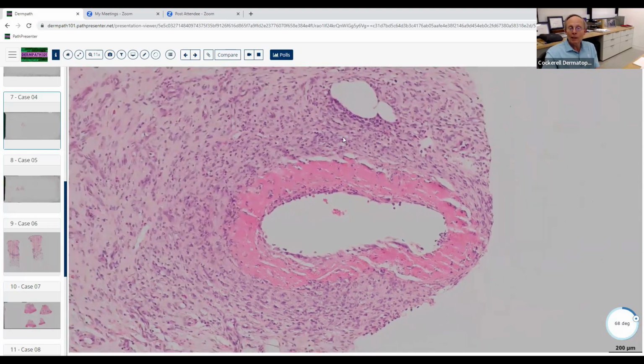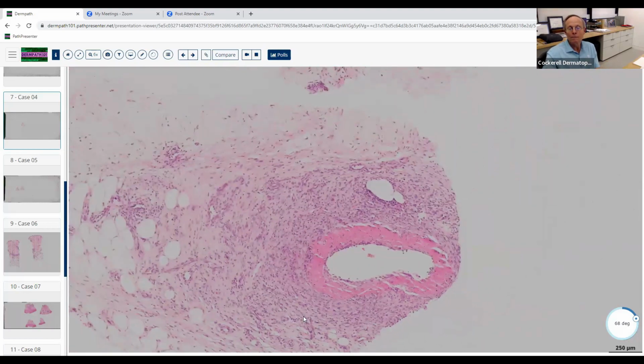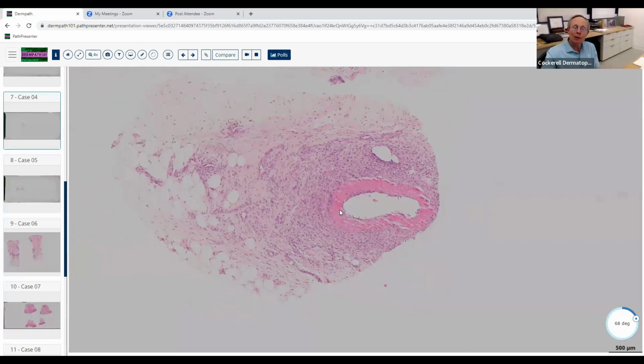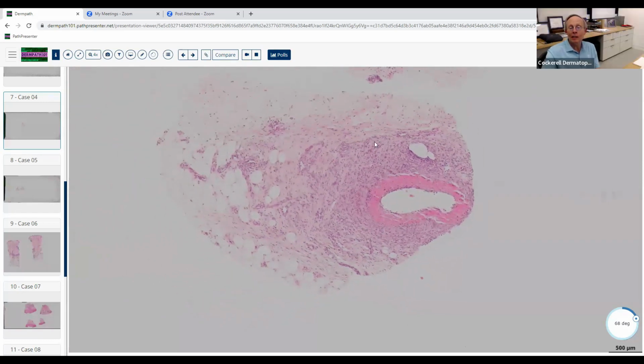Okay, so what's your differential diagnosis for this? For this one, if it's a medium vessel vasculitis and it's mostly neutrophils, I would think about Polyarteritis Nodosa. Okay. Now, when you're dealing with this inflammation way down here in the subcutaneous fat, these blood vessels run in the septa between the lipocytes, right? So we've hit one with our biopsy. We did a good job here. We got lucky. We nailed one. Oftentimes you miss these with the punch biopsy, but the dermatologist got it.